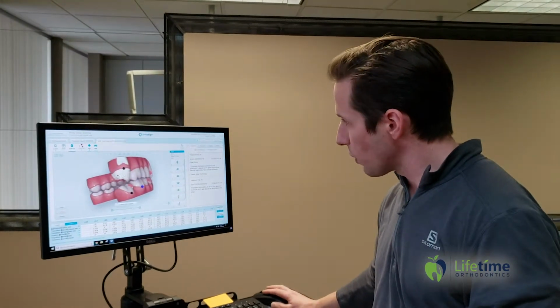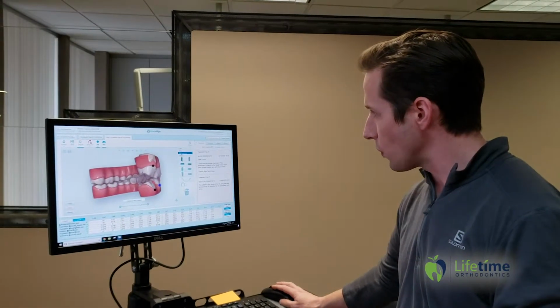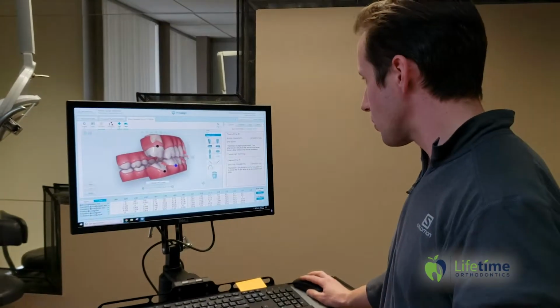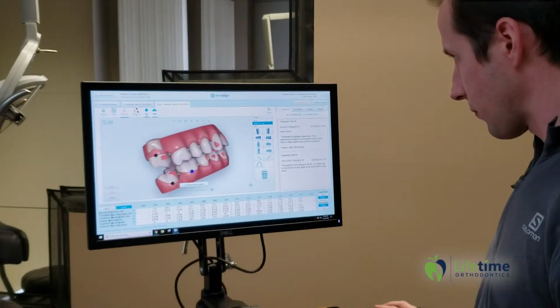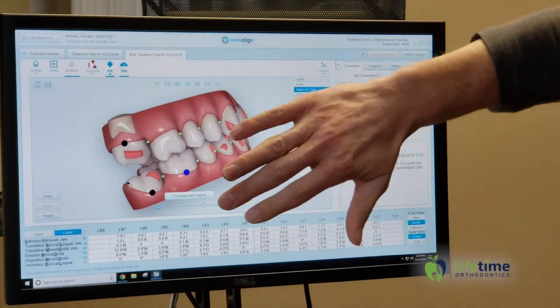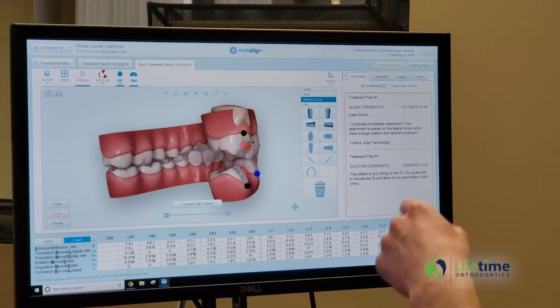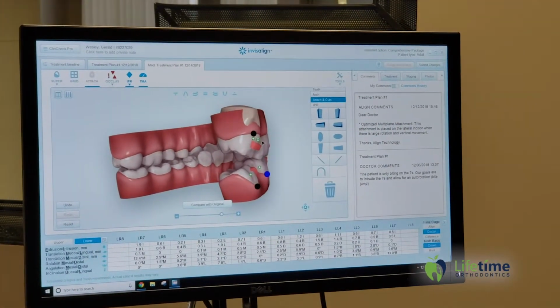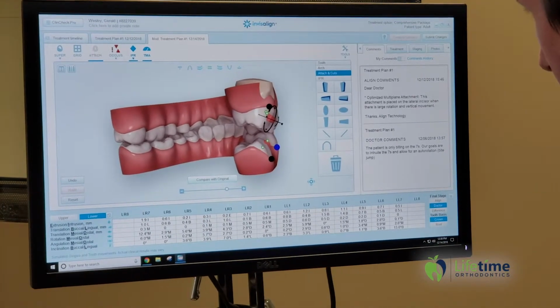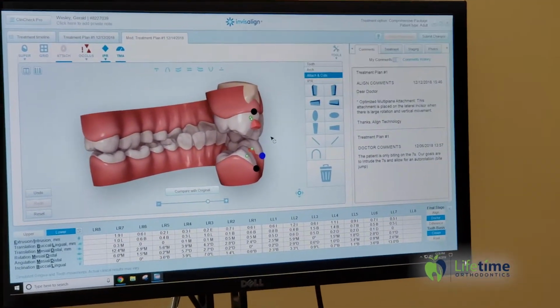And so now the second part to that is I've gotten these teeth out of contact, but the thing that Invisalign, the software, cannot do for you is predict this movement accurately. So I need to put something on here, like this attachment, okay, so that there's something for this tooth to grip on, because that tooth, just from the plastic, is not going to rotate like that, okay? So I need to have something that is pushing down here so that this can push up, if that makes sense. So I put this big old attachment on here because I want to have as much control as possible, okay? I'm going to make that as large as possible, and I'm going to bevel it to the gingiva, so we have a lot of pressure pushing on that point there, okay?